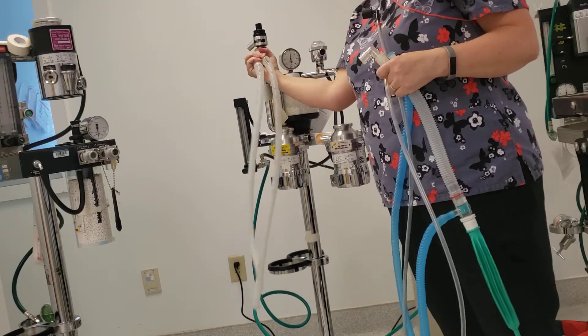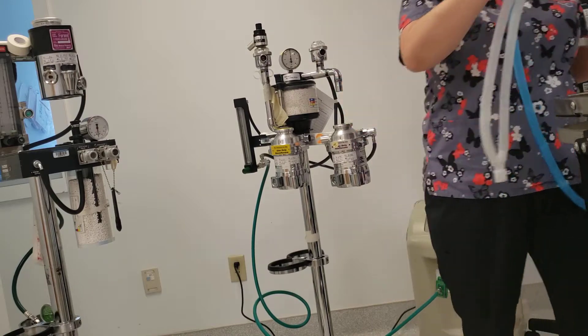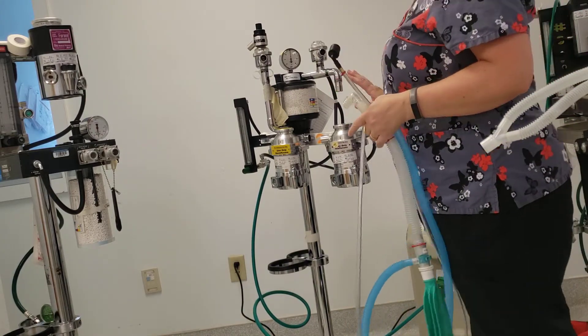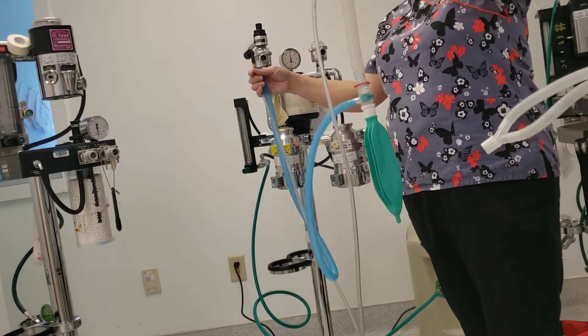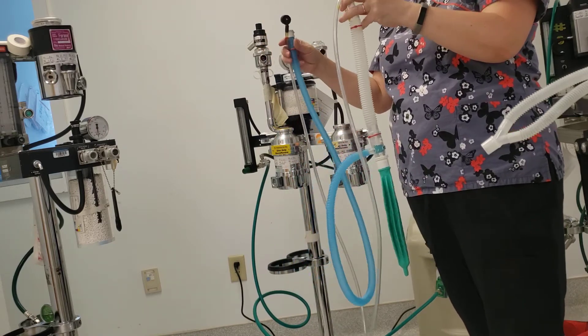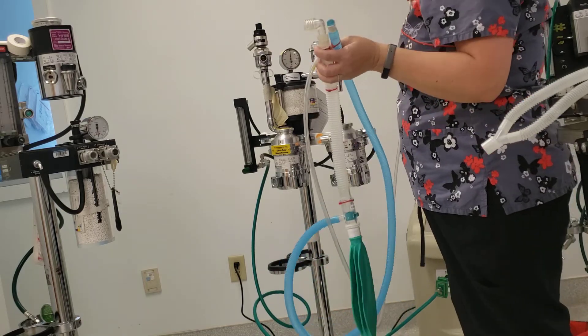To hook it to your anesthetic machine, you're going to disconnect your tubes to your inhalation and exhalation part, because you're bypassing a lot of this. I've already assembled my non-rebreather, so you'll have to practice to know how to take them apart and put them together easily. But in the meantime, I've got it already set up.